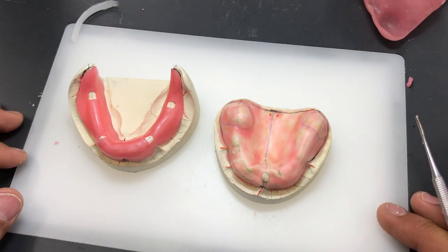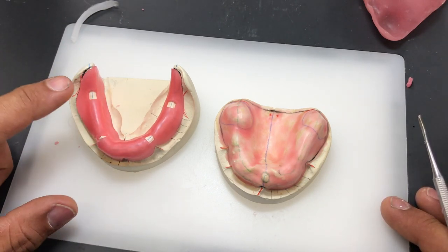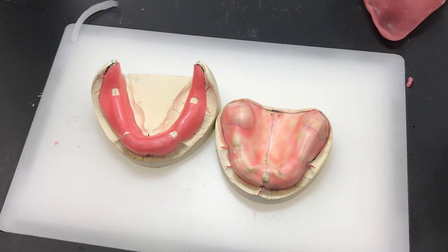Which one I like to use? It all depends on the scenario, but most likely this one, because this gives you more space for your impression material, which will create a mucostatic type of finish for the impressions and not displace tissue, especially if you're working with clients with a lot of soft tissue, mobile tissue.